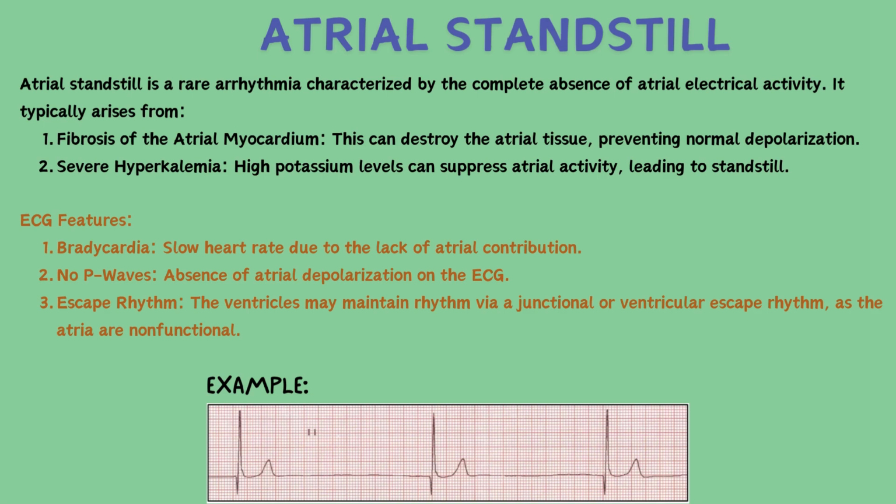leading to standstill. The key ECG features include bradycardia, which is basically slow heart rate due to the lack of atrial contribution, no P waves, which means there is an absence of atrial depolarization on the ECG, and escape rhythm, which means that the ventricles may maintain rhythm via a junctional or ventricular escape rhythm, as the atria are non-functional.